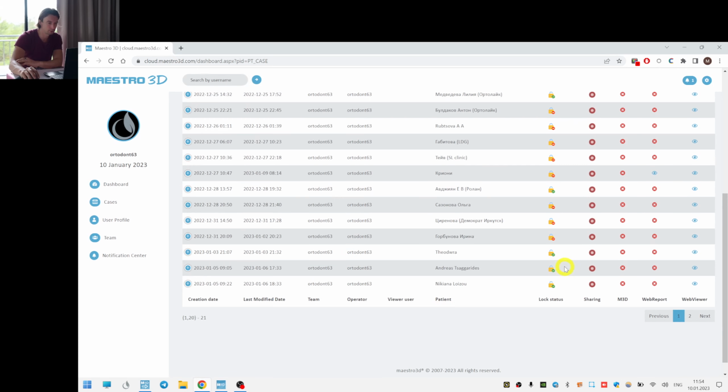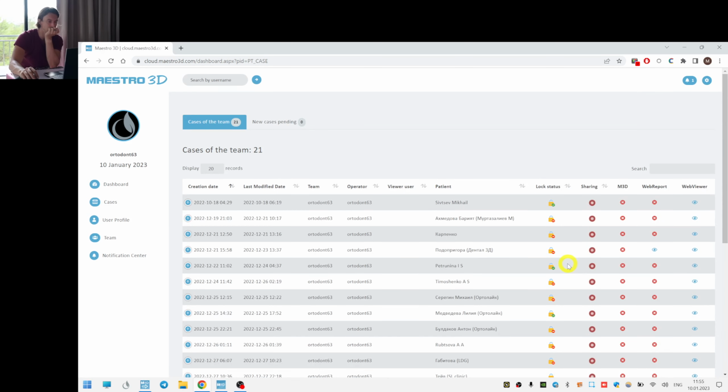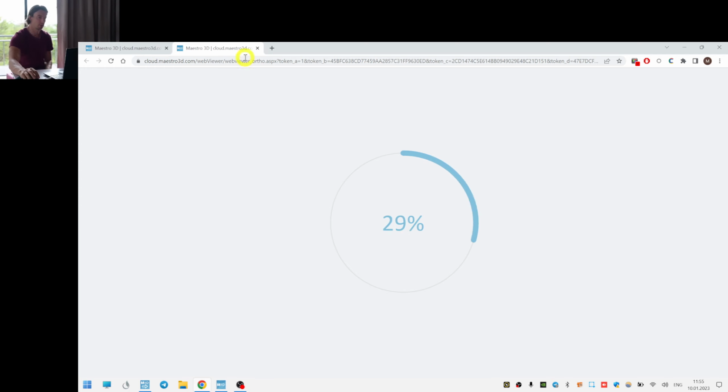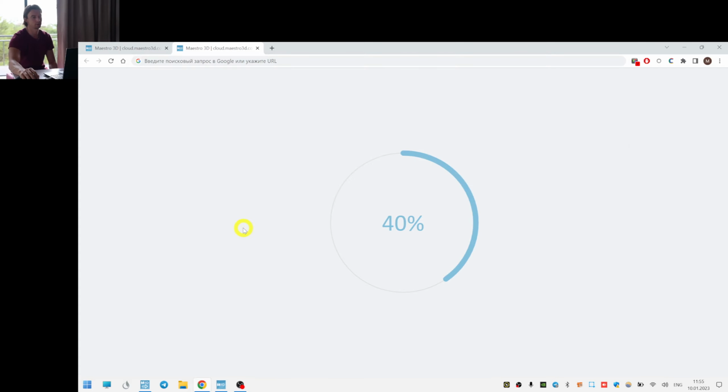And let's find it in the list. Where is it? It's on the second page. Yes, that's it. So now we get a direct link which we can send to our customers so that they can see the setup from any device, even a smartphone.